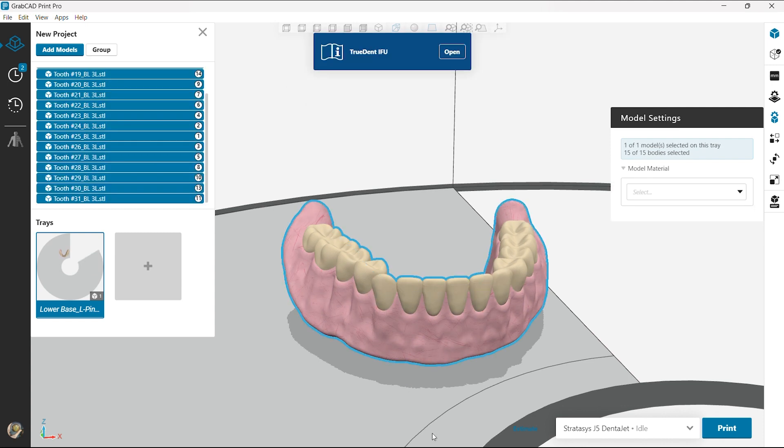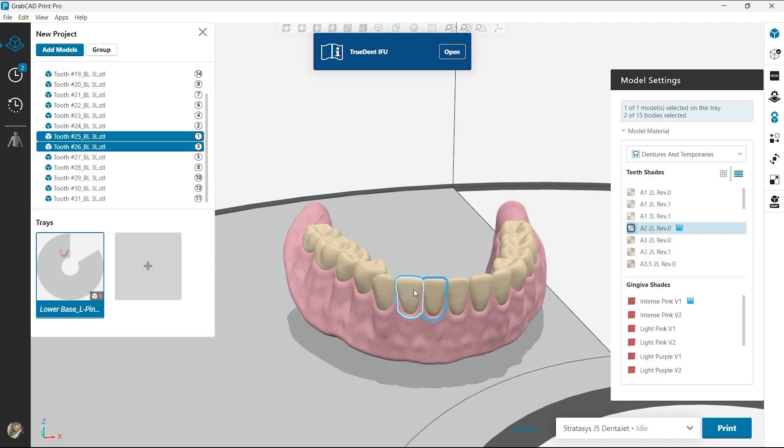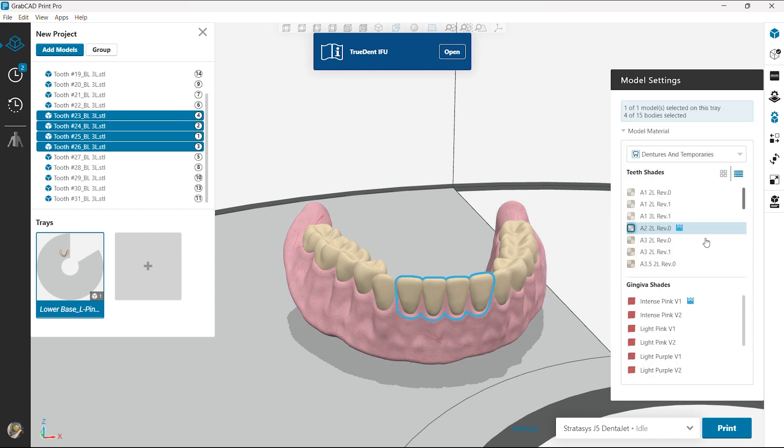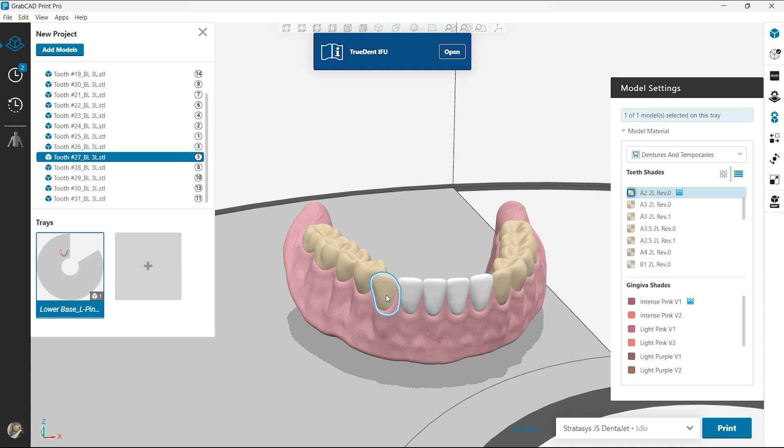So now we have it. Now we're gonna look at different callouts of different teeth. So I'm gonna select the front four and I'm gonna go for something a little bit lighter here, a nice bleach shade here to make it look good.